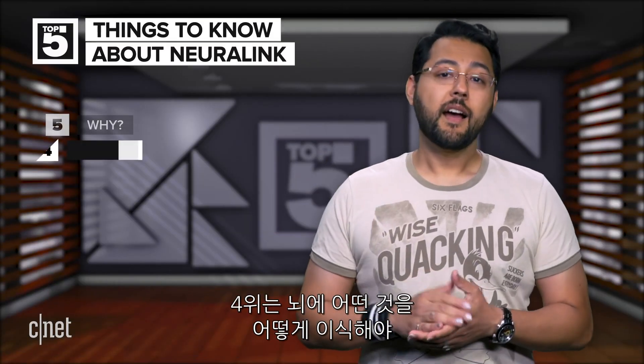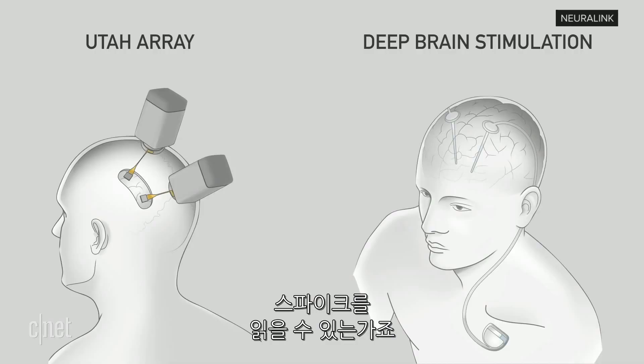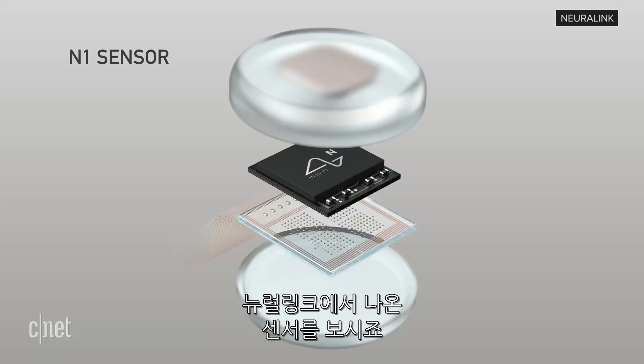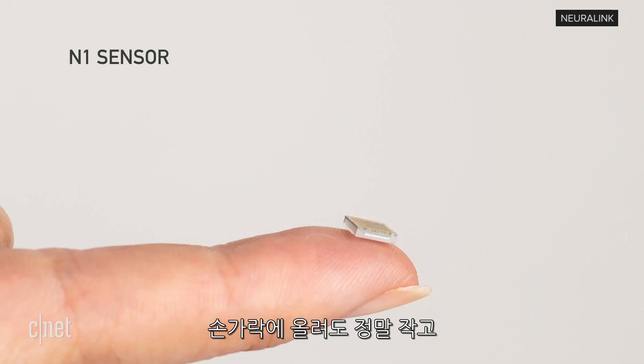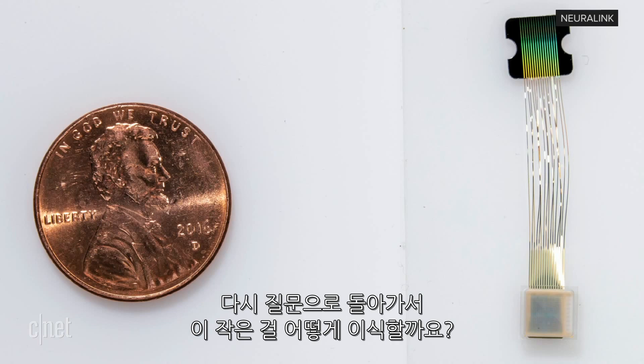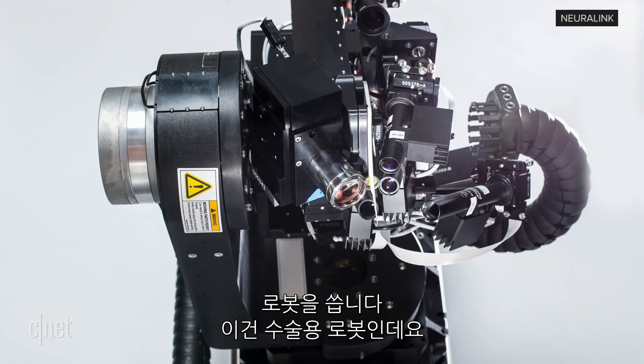Number four: how does one implant something in a brain to read spikes anyway? Take a look at these other implant technologies — one is called the Utah Array, the other is the Deep Brain Stimulator. They are very invasive. Now take a look at Neuralink's N1 sensor. It's tiny. Here it is on a finger, and here it is next to a penny. So how does one implant something so tiny? Build a robot.